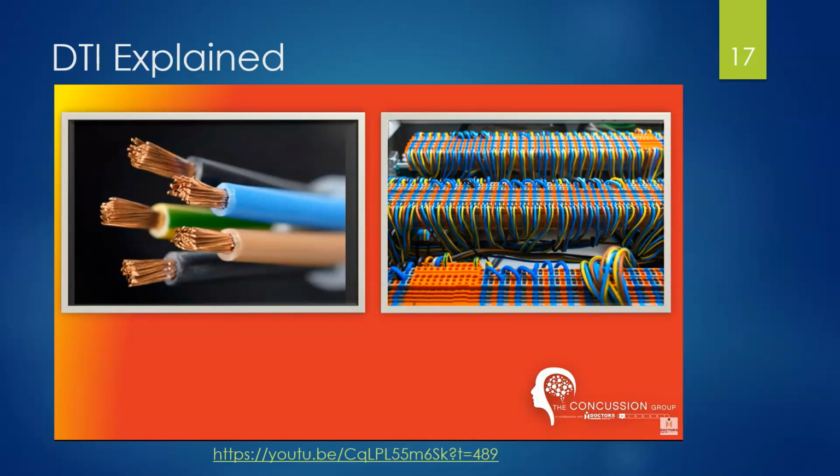So it's protected in that direction. So you need to have insulation from the myelin, which can get damaged. So if you think of it as the electrical circuits of the brain, and you think of all the different connections going in different directions with different colors, you get some idea about what we're studying with diffusion tensor imaging. I know it's complicated, but this is the simplest way to think about it.